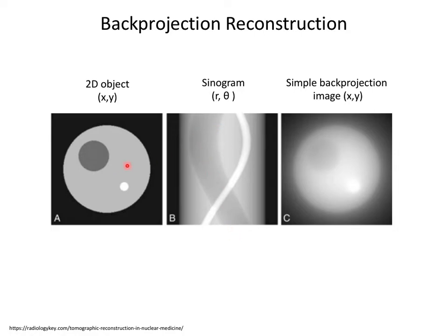Right? So you can see, because this is a trivial image, it's very simple. This big old object here is this thing sweeping through, right? And this bright object here is this thing sweeping through, right? Just for fun, you can in MATLAB or whatever, create different objects and take a look at their sinograms. And for yourself determine, okay, what determines how this thing changes as a function of theta, right?